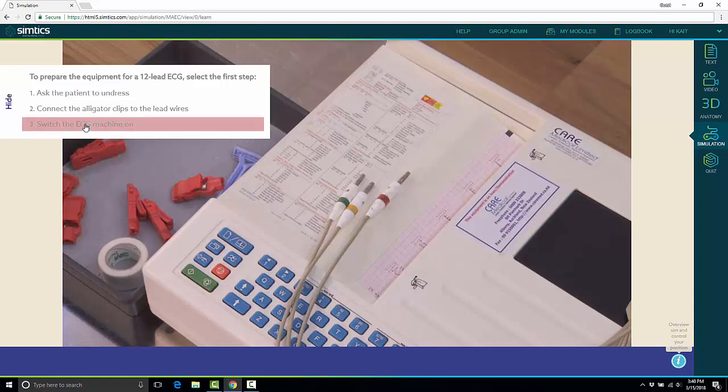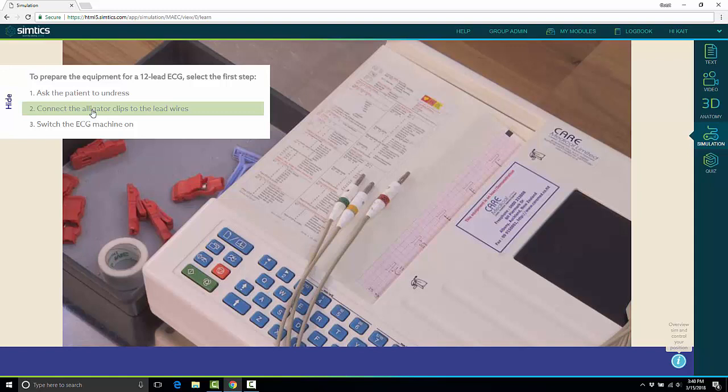The first few steps of this particular procedure is setting up the EKG machine. There's going to be some multiple choice type questions here to test students on their knowledge, see if they know what the first step is when it comes to setting up the EKG.